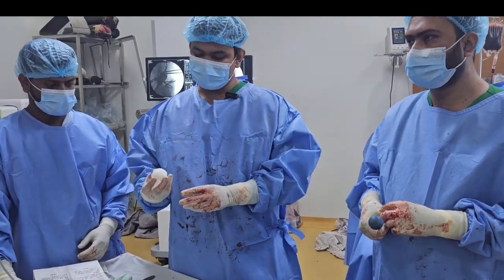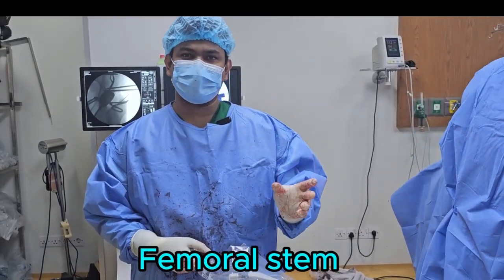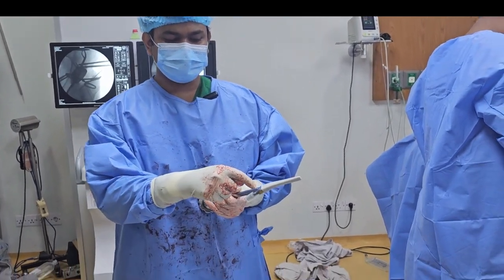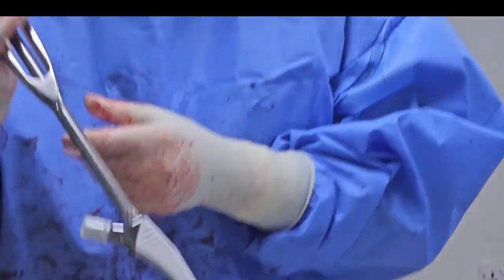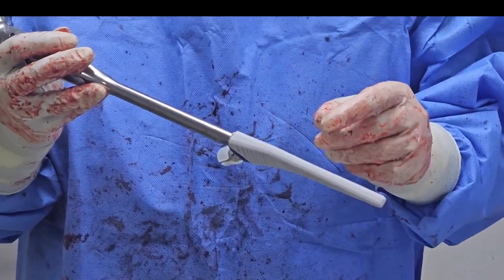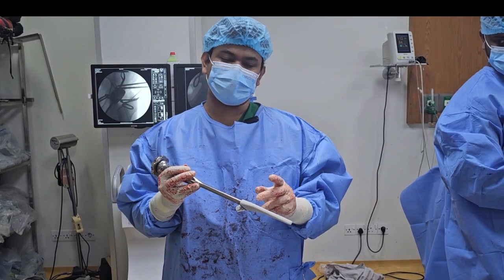This is the femoral stem — non-cemented. This is titanium metal with a hydroxyapatite crystal coating. This coating promotes bone growth in the body — it acts as a biological agent for osseointegration.